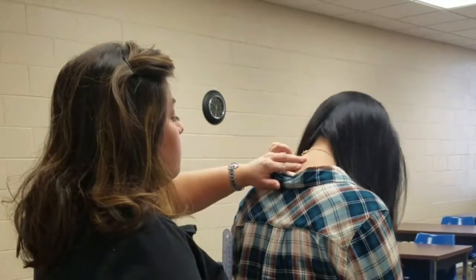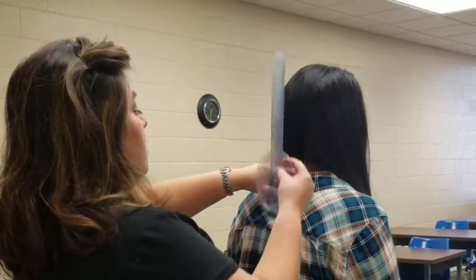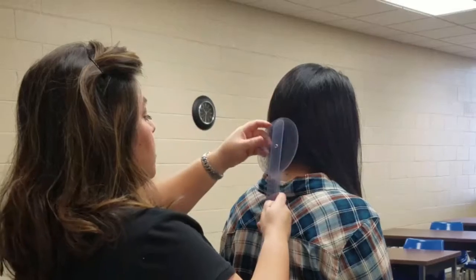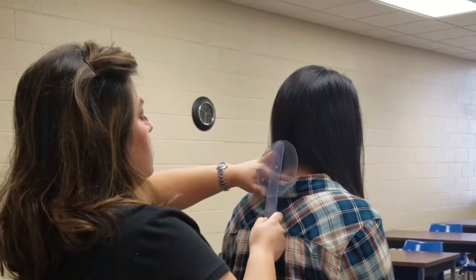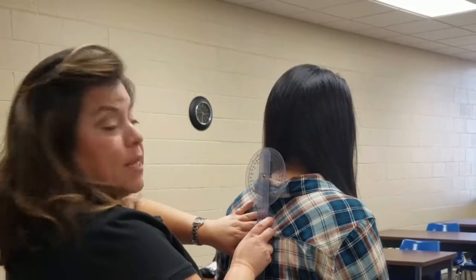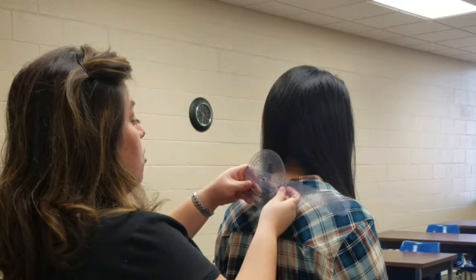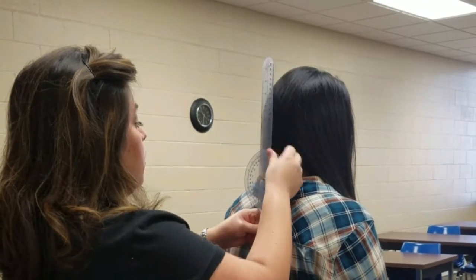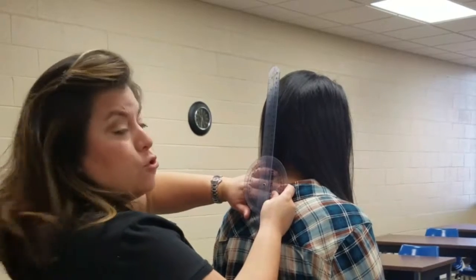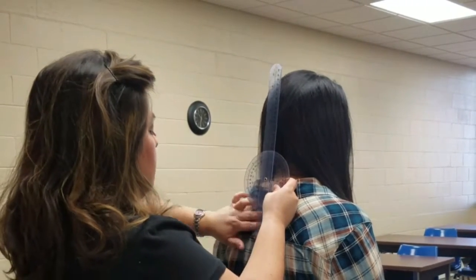Can you put your chin down a little bit for me? Okay, so I have it right here. Can you look up straight ahead, please? So fulcrum over C7. We have our stationary arm, which is going to go along the line of the spinous processes of the thoracic vertebrae. And we're going to align the movable arm with the occipital protuberance. All right, so here I am.